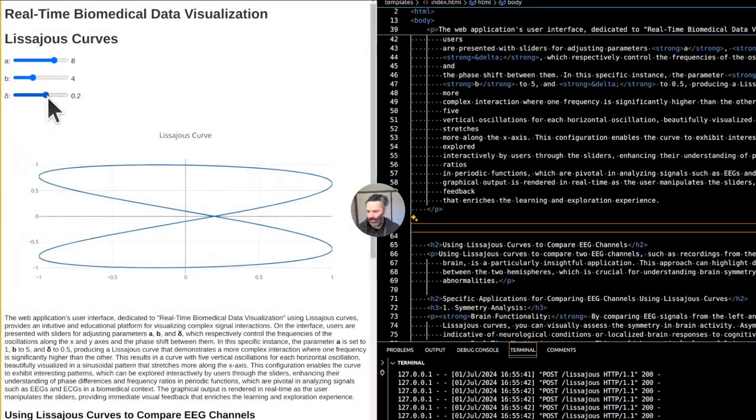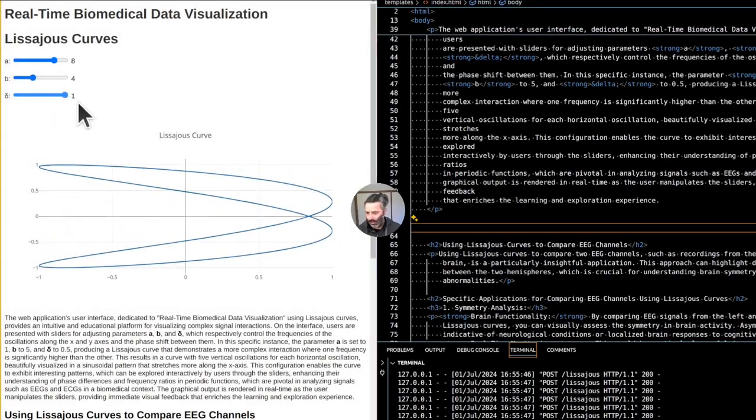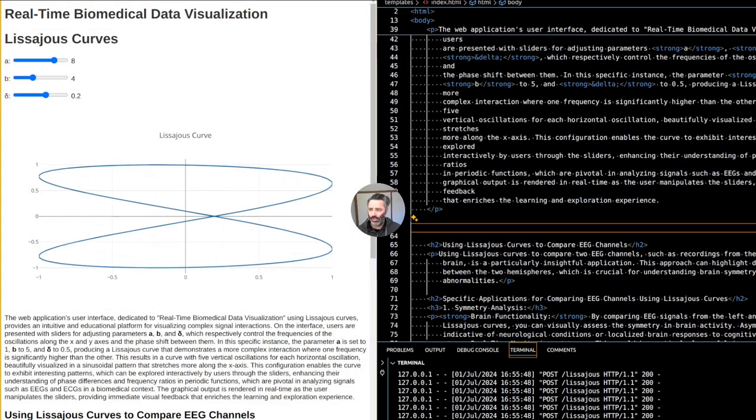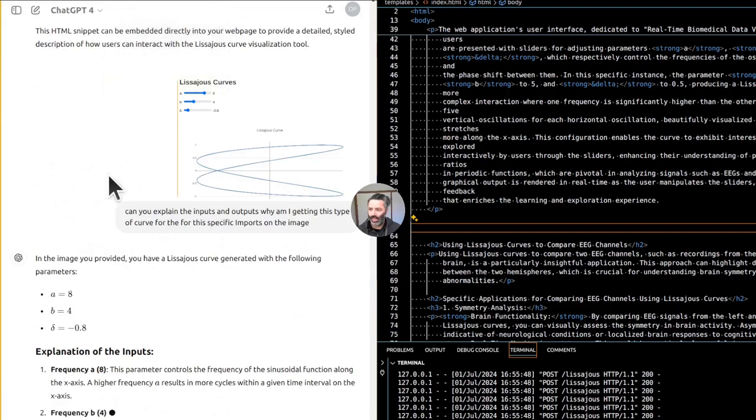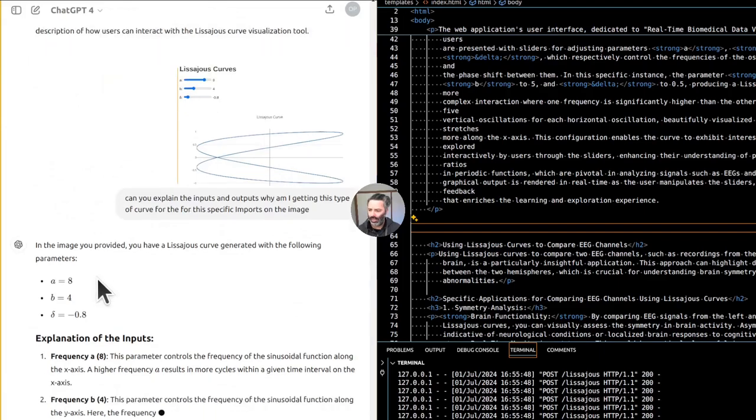Delta there should definitely be from minus 1 to 1, so you can change phase. That's the phase.